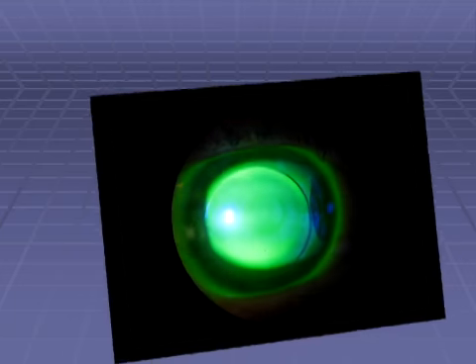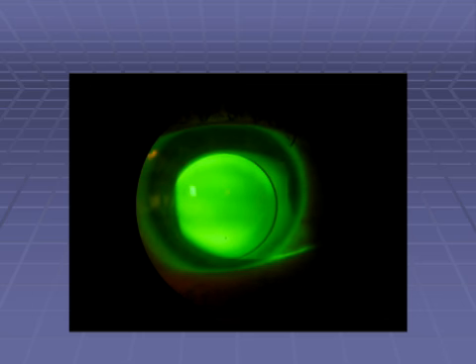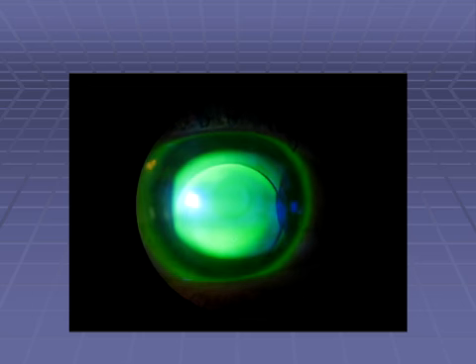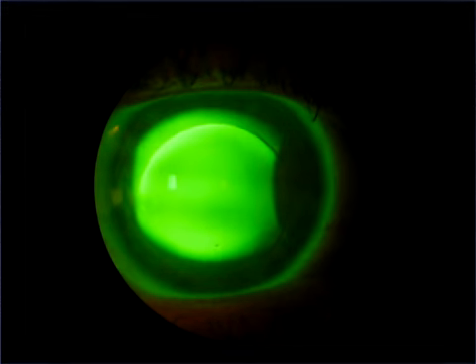For contact lens practitioners, OculoCAM provides access to fitting methodology once limited to large practices and teaching institutions by allowing real-time video of fluorescein patterns for fitting and consultation to be made at a nominal cost. Once you are familiar with the system, videos take only minutes to acquire and will save you valuable chair time and enhance the fitting process.